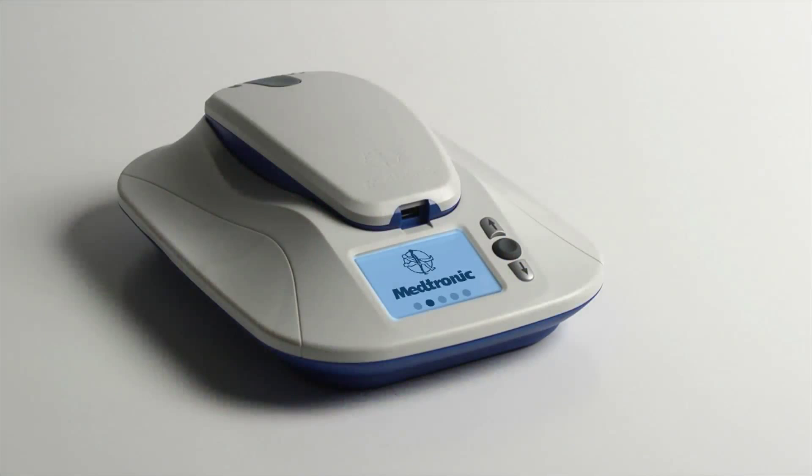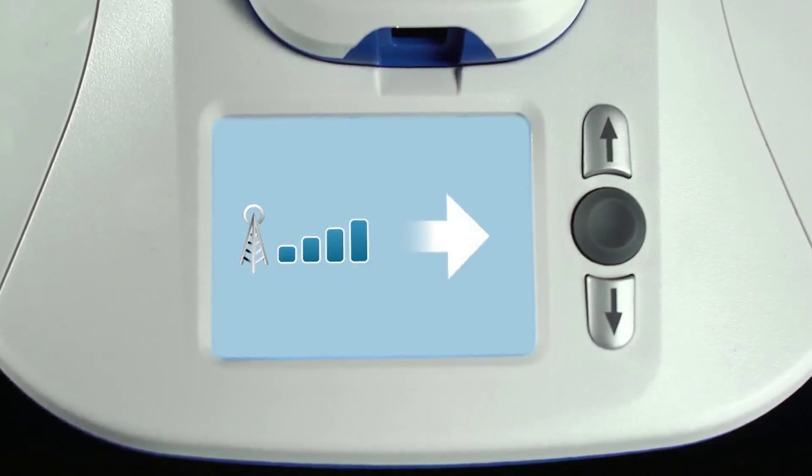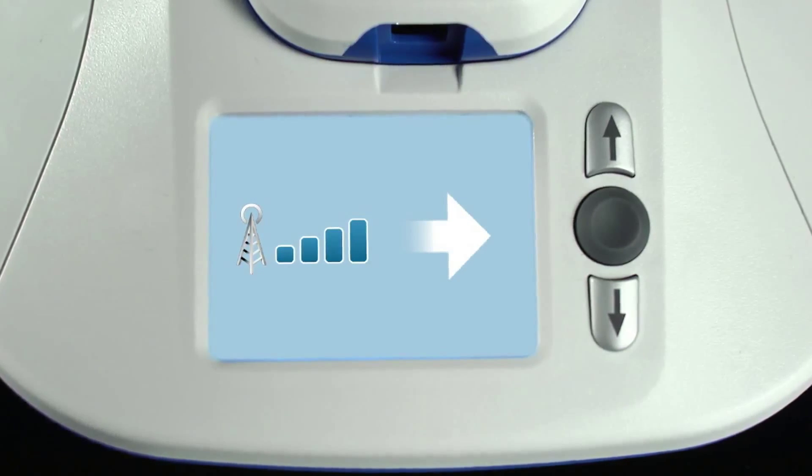After you plug in the monitor, the Medtronic logo will appear for a minute or two while it powers on. Then you should see this icon which indicates the monitor is connected to a cellular network. Although the MyCareLink monitor will automatically send your heart data on a regular basis, a single manual transmission is needed as part of the initial setup process. This setup transmission is needed only once.